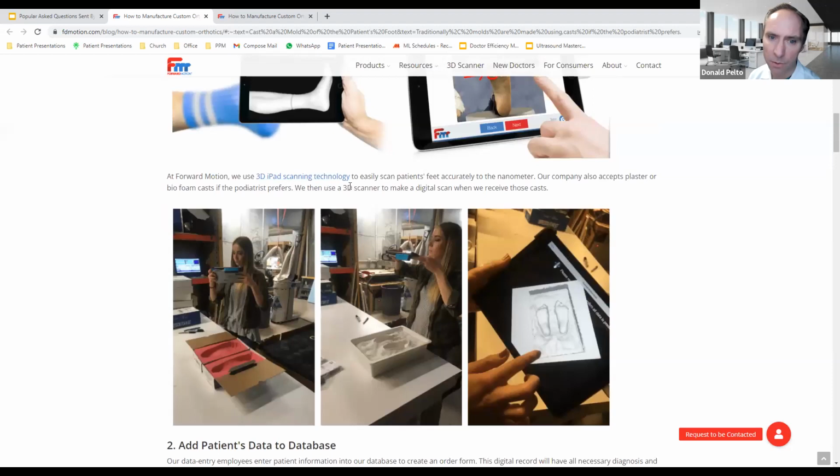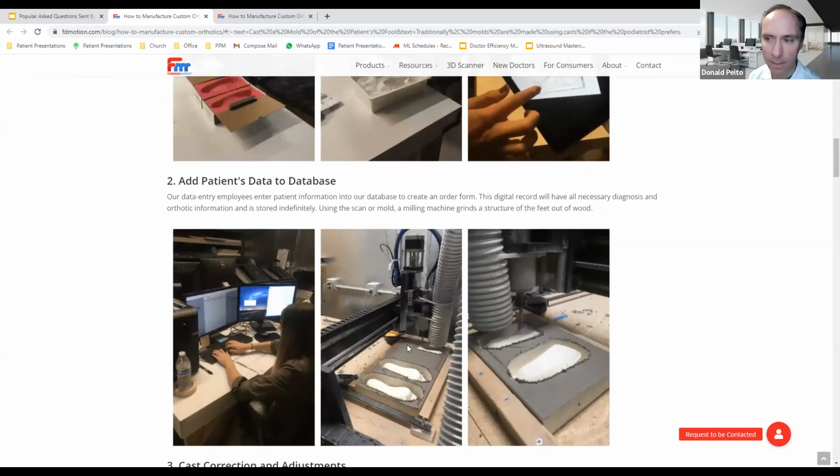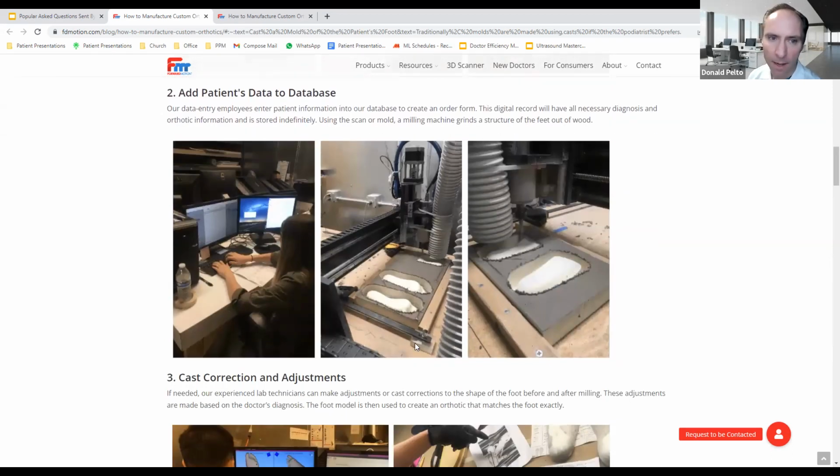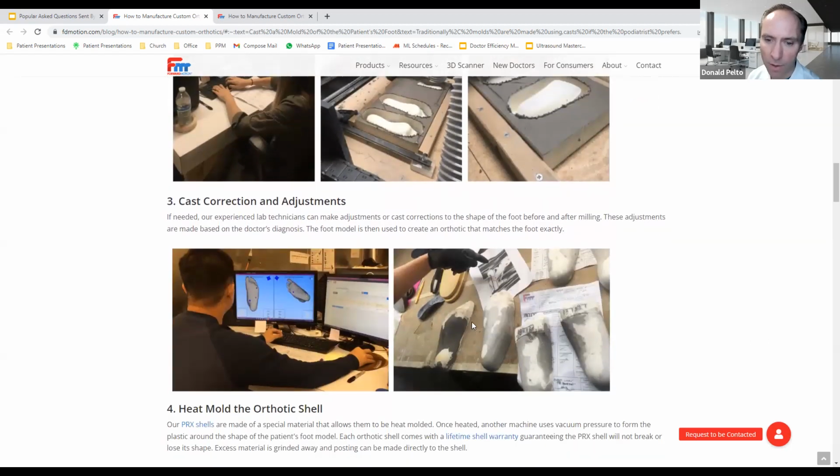They can either use the scanning, or people used to send plaster casts, which is an example right here of a plaster cast, or they do foam boxes. We choose not to do those unless you have a really flat foot. If you have a very flat foot, sometimes I'll still do a plaster impression. Then from that, they add it to the computer database, and they make a negative impression of it, meaning they make a negative of what the foot looks like, and then they can form the orthotic on top of it.